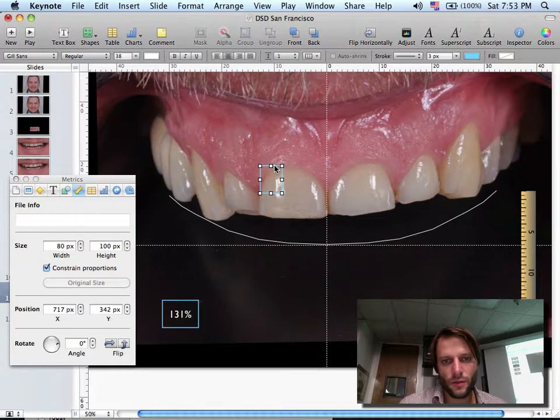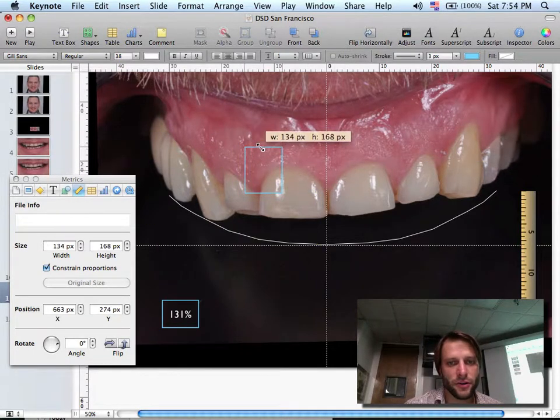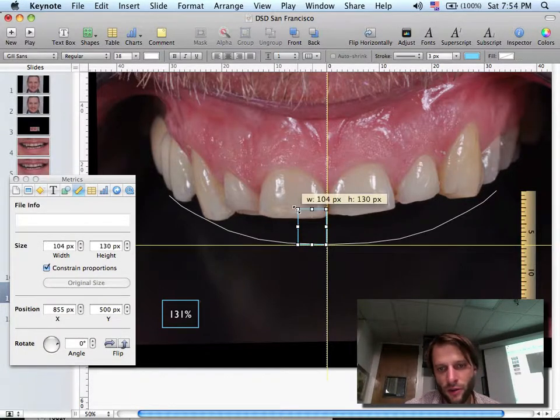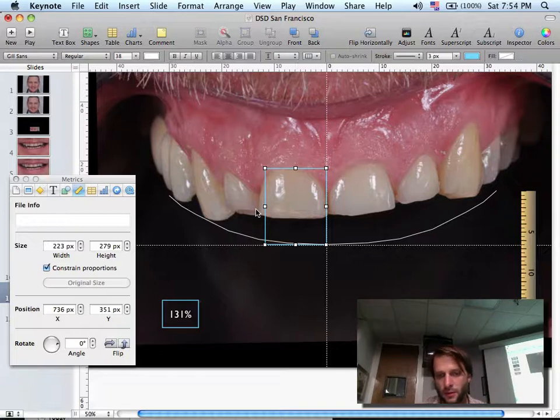Once I have this rectangle and it's locked, what does that mean? That I can change the size without changing the proportion. Okay? So I'm going to bring this rectangle so it touches the axis of the cross here, the intersection. Once it's touching here, I can then grab this corner and change the size of the rectangle. And then usually I stop when it touches either the cervical or the width, and I make the first analysis. The first analysis here is that if I keep this midline where it is, if I keep the incisal edge like this, if I don't want to change the cervical, that's the relation between the ideal proportion and where the distal of the tooth is.